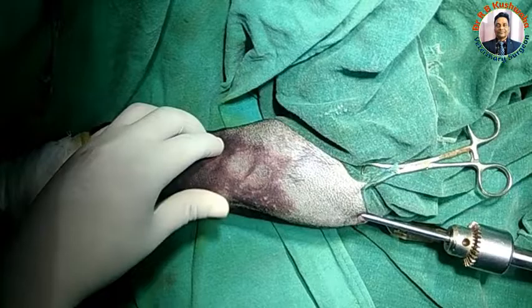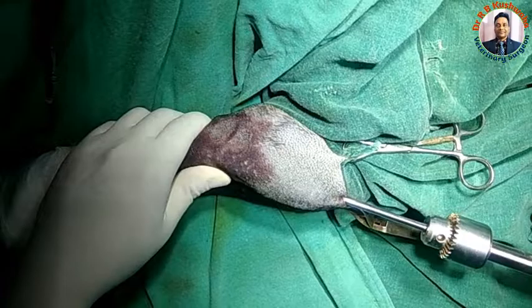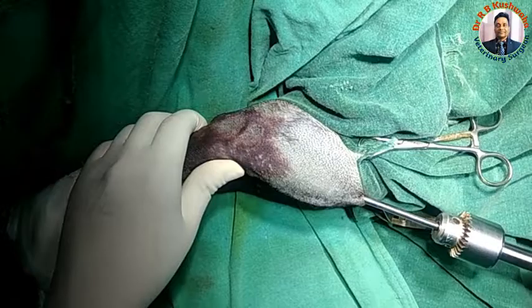One aspect of the manipulation is that it is sometimes more involved than open reduction, but once you reduce the fracture fragment by the closed method the healing will be faster.